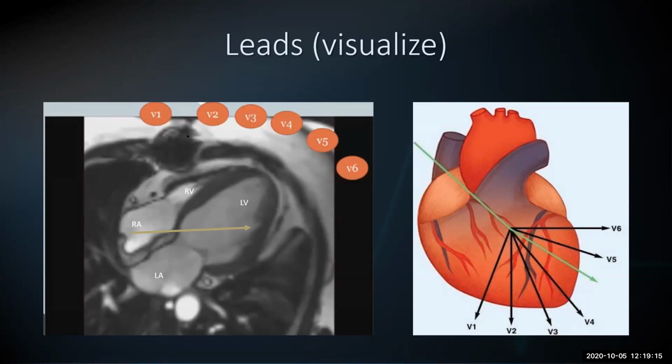So if we're thinking about infarctions or areas of infarct, we're thinking about that with the LAD or so. And then V4, 5, and 6, you can see that that's capturing maybe some pathology on the left side of the heart. So then we're thinking more like left circumflex or true left ventricular isolated involvement. This is definitely not absolute.